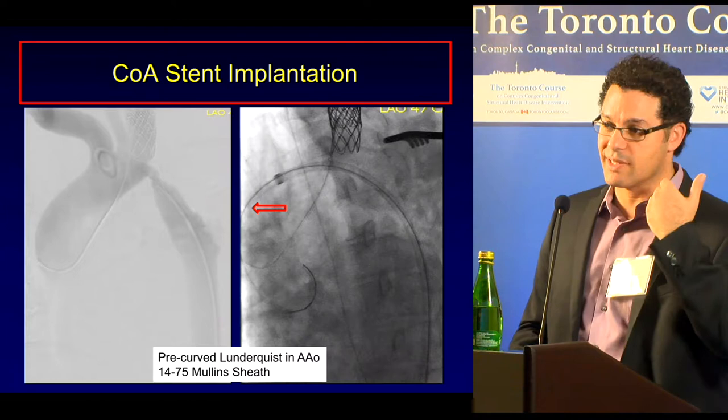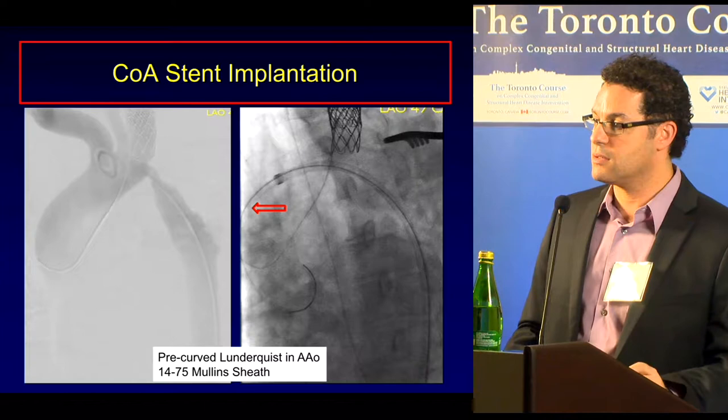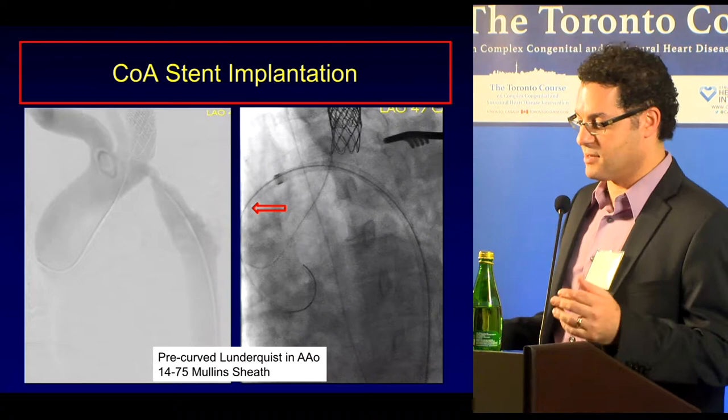But it's the ipsilateral side. So as long as the vertebral on the ipsilateral... No, the vertebral's got to be open on the other side. So the right vertebral. Well, if the circle of Willis is intact, as long as your carotids are open, the flow is about the posterior circulation. And some people are naturally dominant in one vertebral or the other. You can't just be open; you have to make sure it's not the non-dominant vertebral. Or you can just not seal it, and then you don't have to worry about any of this discussion. So that's what I did.